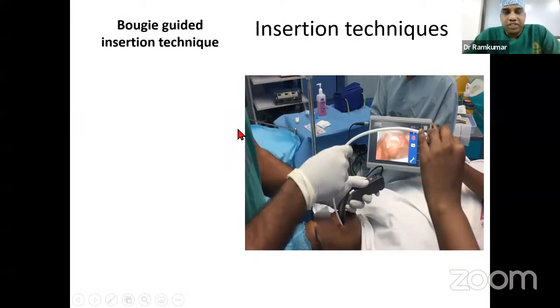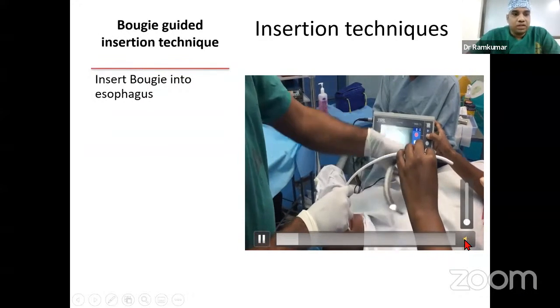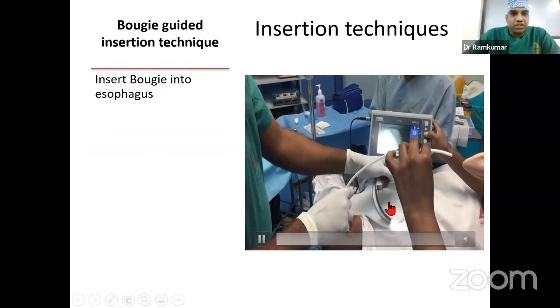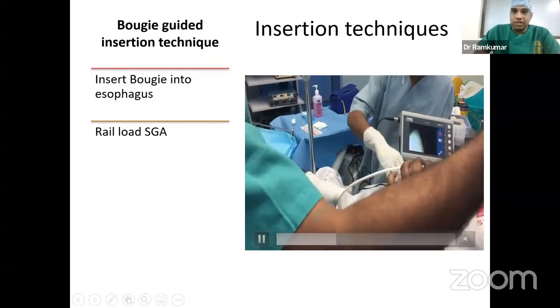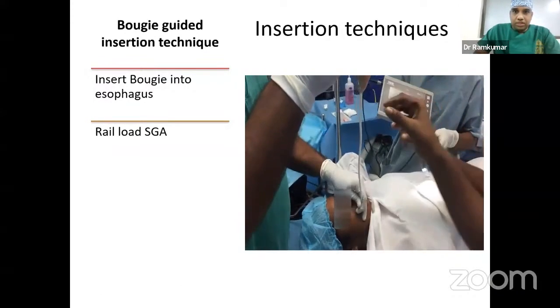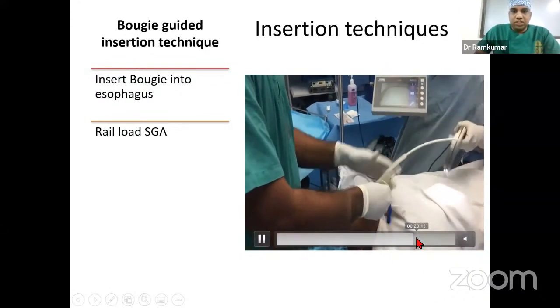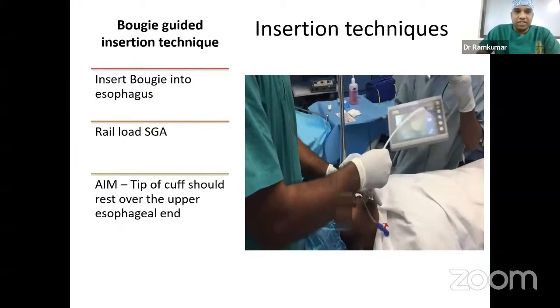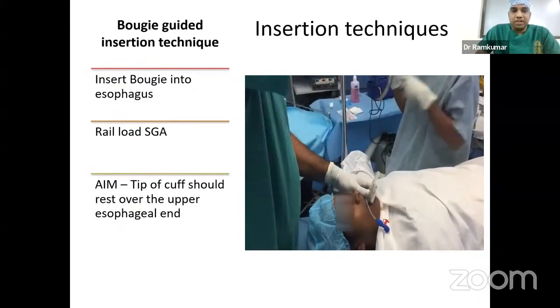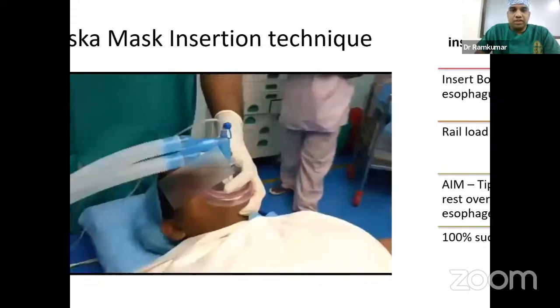Coming to the bougie carrier technique, which gives a 100% success rate. See, I'm passing a bougie into the esophagus. That's a vocal cord, that is an esophageal opening. I'm placing that. Insert the bougie into the esophagus and railroad the LMA through the drain tube. And that is done till you get resistance. So this gives a success rate which is close to 100%. The aim is to place the tip of the cuff at the upper esophageal sphincter. So that gives a very good placement, and success rate is quite 100%.